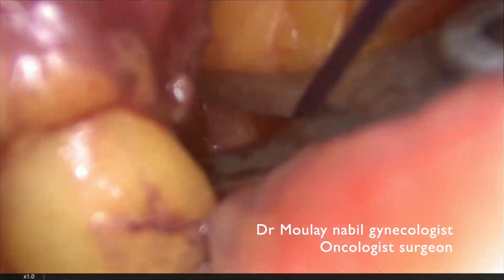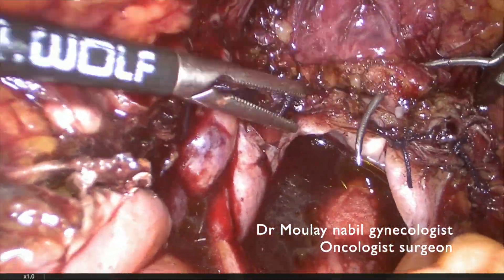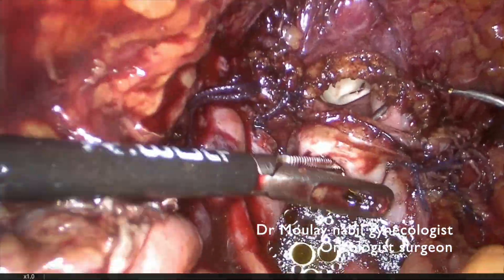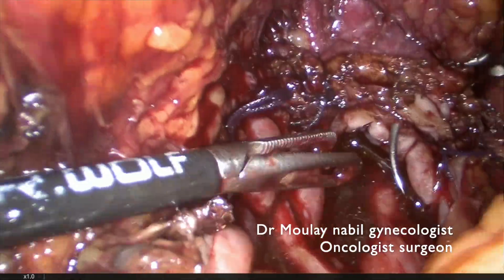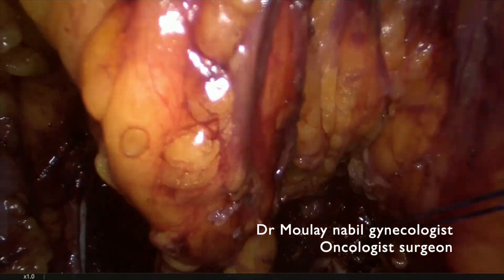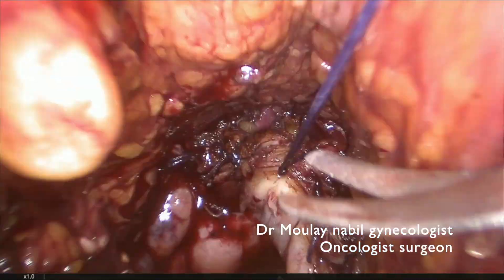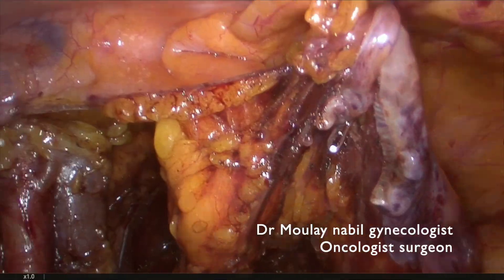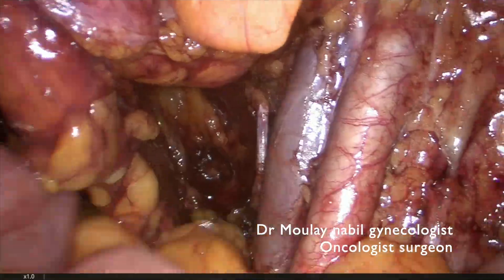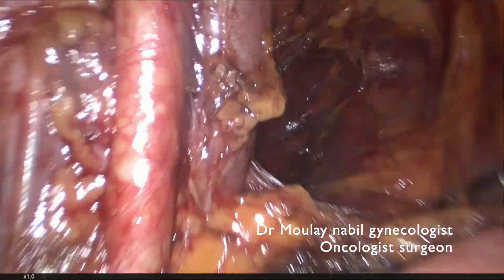You can see how challenging this kind of surgery is in fatty patients, but the laparoscopic approach, in my opinion, is the best way to treat this kind of gynecological cancer. This is our technique for doing this surgery. I hope this video was interesting for my colleagues. Controlled lymphostasis and hemostasis — thank you very much for your attention.